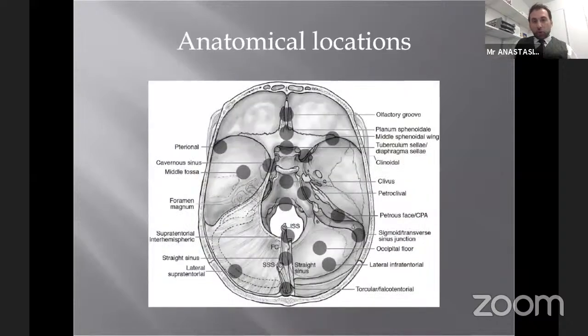This slide shows where we will identify neoplastic tumors, specifically meningioma pathology, in the anterior cranial fossa. Starting anteriorly, it's the olfactory groove, the planum sphenoidale, the tuberculum sellae, and then the orbital roofs laterally, as far as the anterior fossa is concerned.